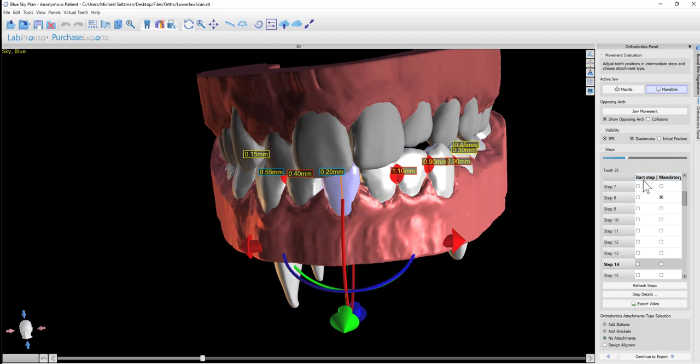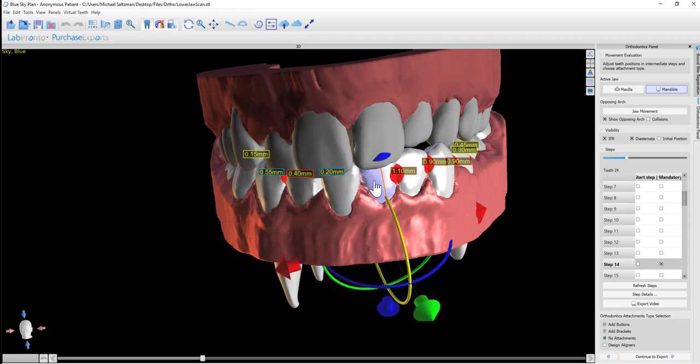And the other options that we have is we could define the start step. So if we've clicked on a particular tooth, and now we're looking at tooth number 24 that we see here on the right-hand side, and we want to make sure that tooth 24 starts moving early or starts moving later in the process, you could check the checkbox for start step, and it will force the tooth to start moving at the designated step.